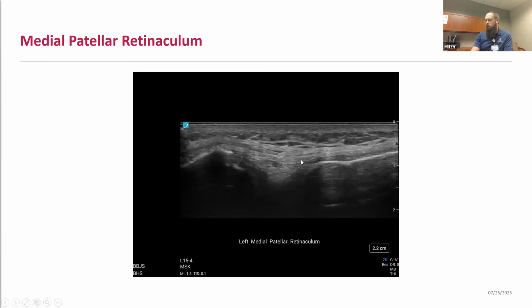In this evaluation, typically you want the knee in full extension to identify fluid within that recess, because as you start to go into flexion, it will typically push it out of that recess if you've only got a small effusion. Larger effusions may still distend that area, but more mild or trace effusions, you may only pick up with the knee in full extension.